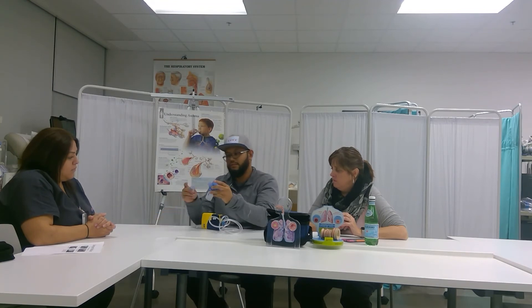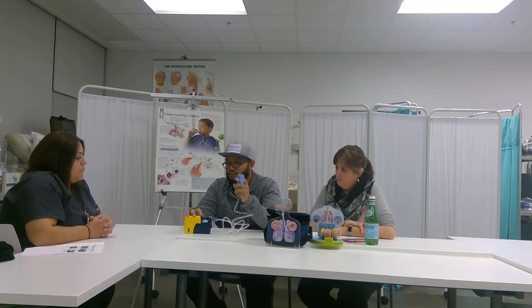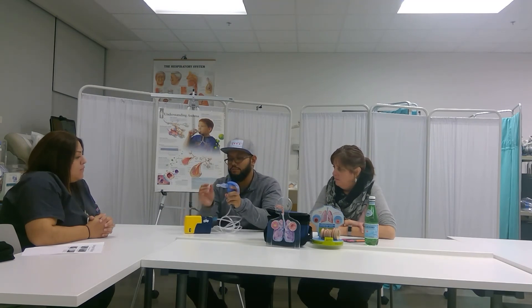I want to disconnect it, disassemble it, and I want you to teach me back how to do it. So first, I take the tubing and connect it to the compressor, and then attach the mouthpiece to the medicine cup. Then I turn my compressor on, open it, open up the top, put all the medication in there, close it, and then attach the other end of the tube to my medicine cup. Then turn on the switch, and I should be able to see the mist. Yes, that's right.